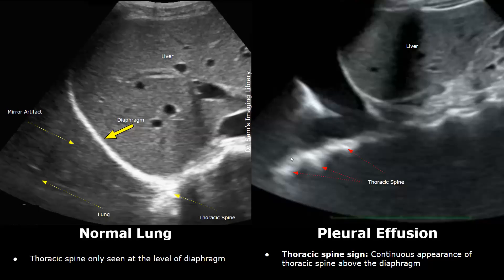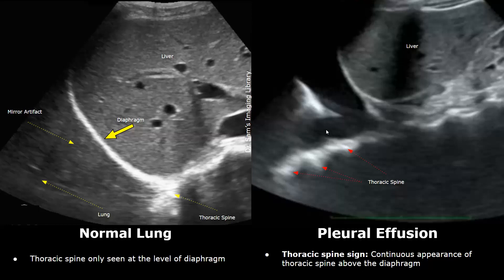You can see a continuous curvilinear hyperechoic structure above the diaphragm as well as below the diaphragm — this is the thoracic spine. It is more clearly seen in cases of pleural effusion because the pleural fluid acts as an acoustic window. The ultrasound waves easily pass through the fluid, which is why the thoracic spine is visible. This is the thoracic spine sign.